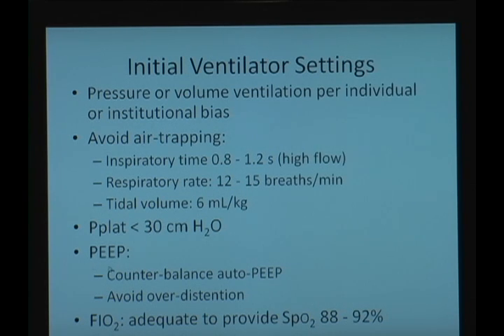As far as PEEP, we may use PEEP to counterbalance auto-PEEP. More detail about that later. But we want to be careful that if we use PEEP, it doesn't drive up the plateau pressure and make overdistension even worse. And we want to target an FiO2 again so that we have a saturation of around 90%.